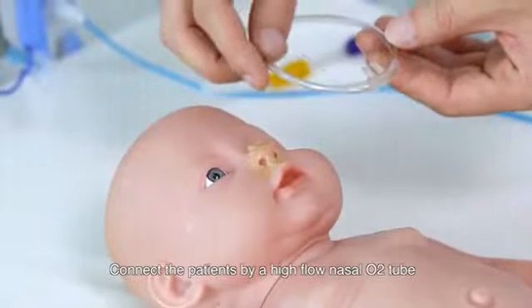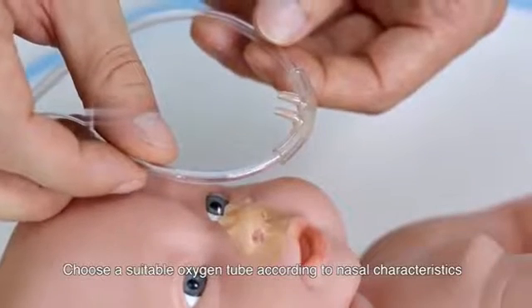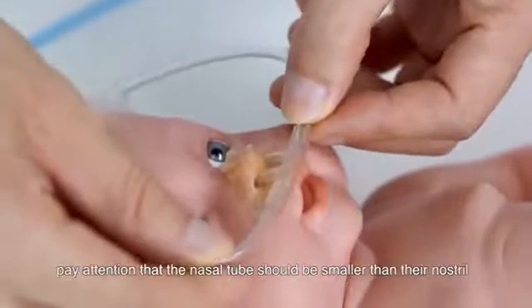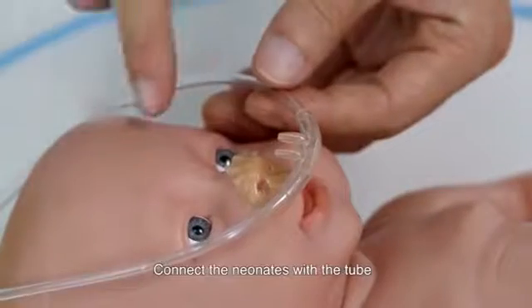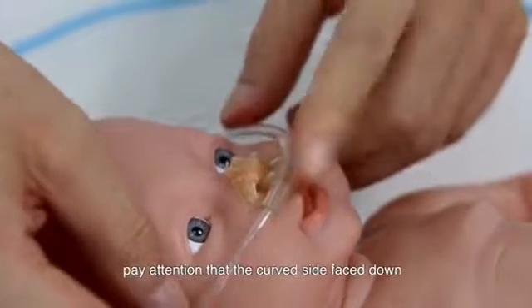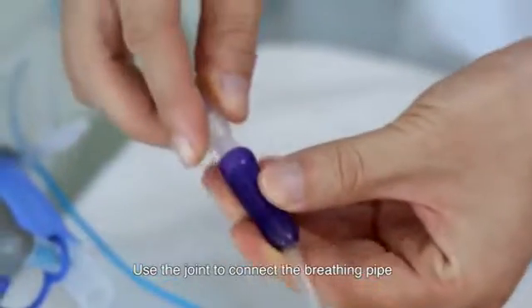HFNC mode. Connect the patients by a high-flow nasal oxygen tube in oxygen therapy ventilation mode. Choose a suitable oxygen tube according to nasal characteristics. Pay attention that the nasal tube should be smaller than their nostril. Connect the neonates with the tube. Pay attention that the curved side faces down. Use the joint to connect the breathing pipe.